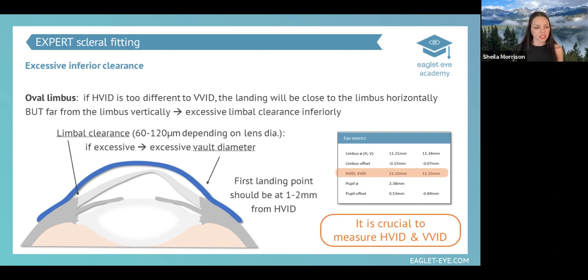In the image, you can see it's actually a beautiful fit where we have that junction. You can see a cross section with an OCT to identify where the limbus is, and lenses should not land inside that area.